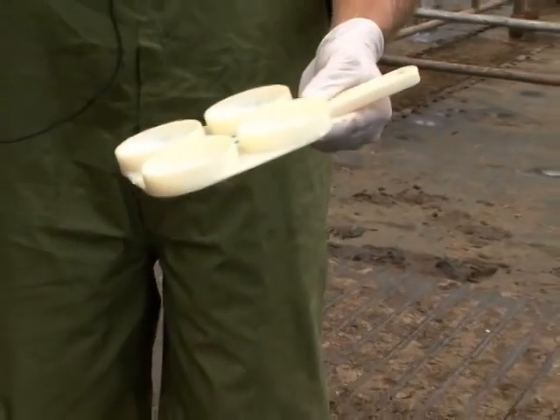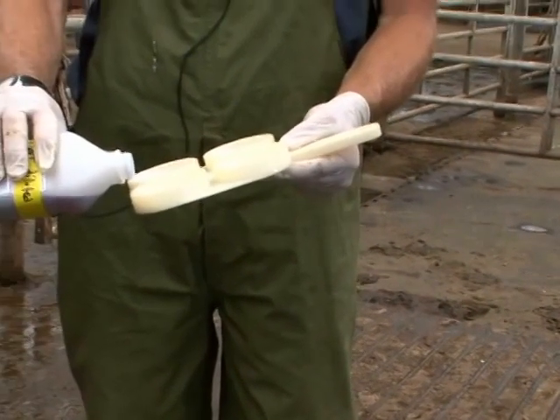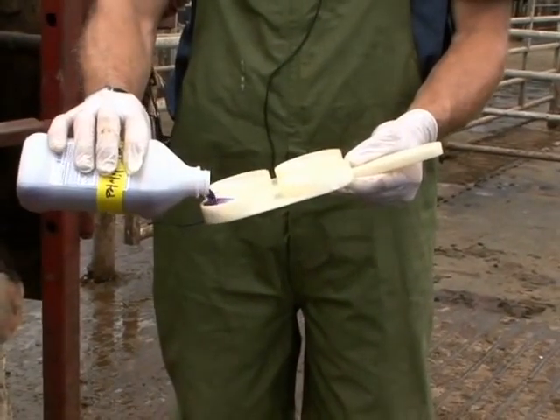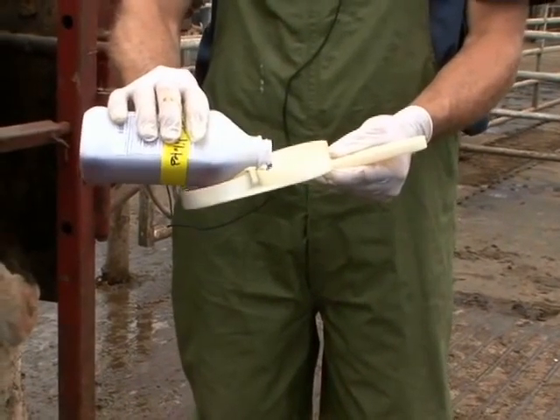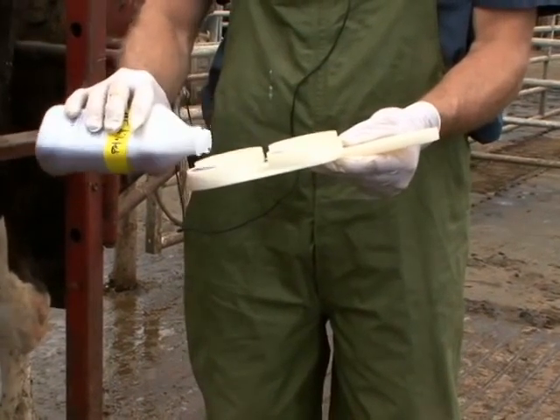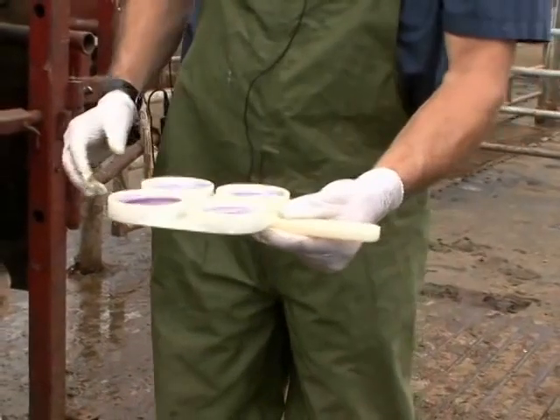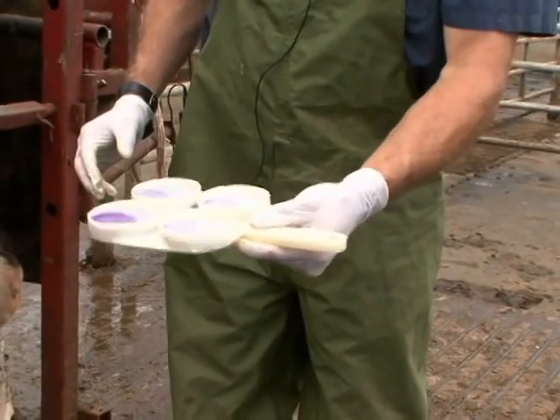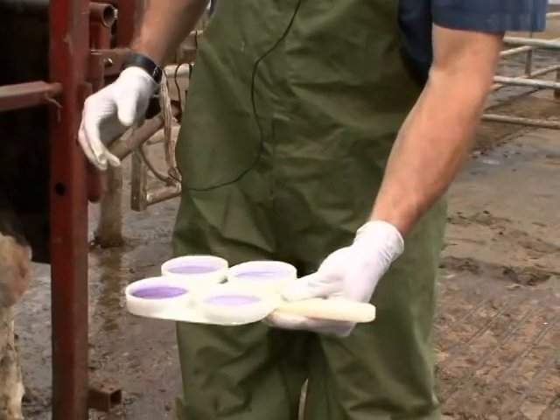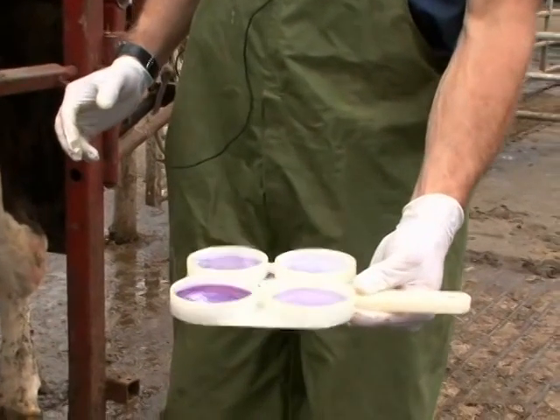And then we add an equal amount of reagent to milk per well. So this isn't an exact sort of measurement. It's cow side. We just try to guess or estimate how much milk is in each of these wells, and we add the reagent to each of these wells. And then once we have enough reagent in each, we start to just rotate it and shake it and rock it back and forth and rotate it back and forth until we get a complete mixture of the reagent with the milk.